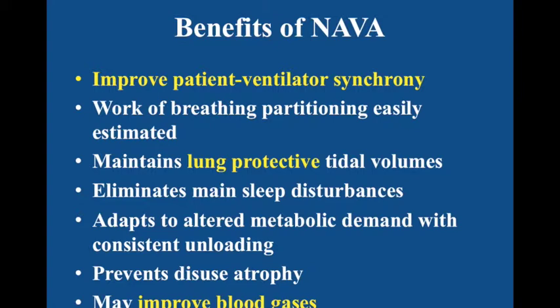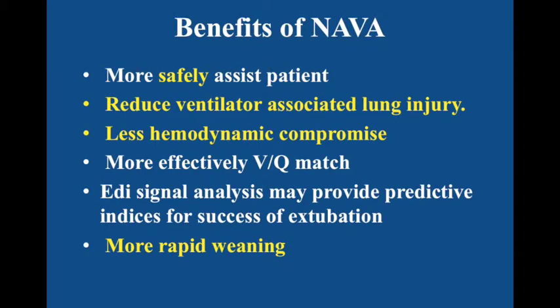It may improve the patient's blood gas, and it's safer for the patient. It can reduce ventilator-associated lung injury, cause less hemodynamic compromise, and also make the V/Q match more effective. Edi signal analysis may provide a predictive indicator for the success of extubation, so it can give a better weaning rate.